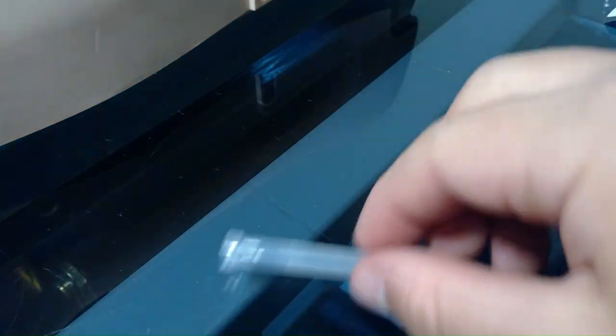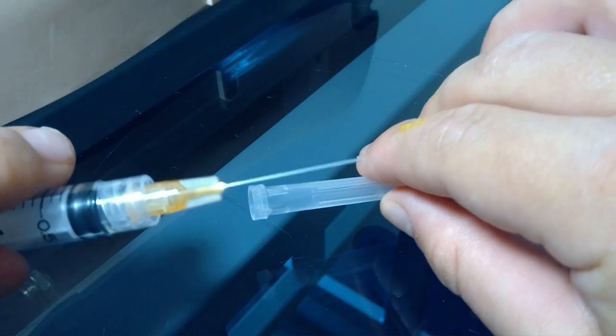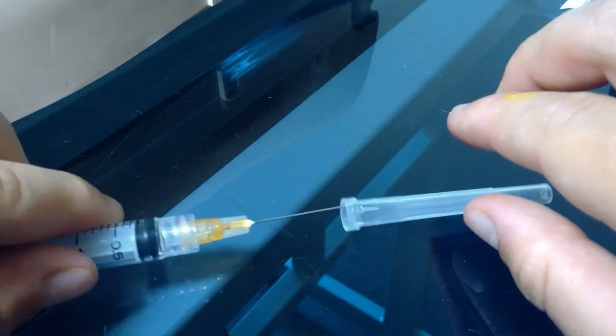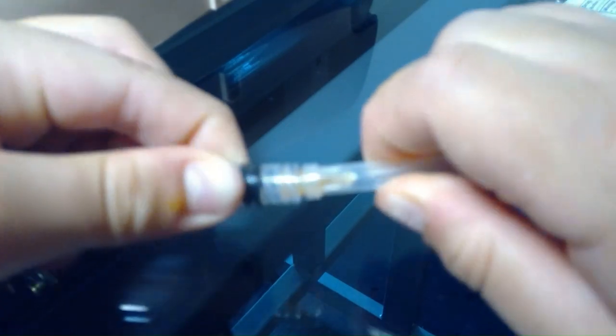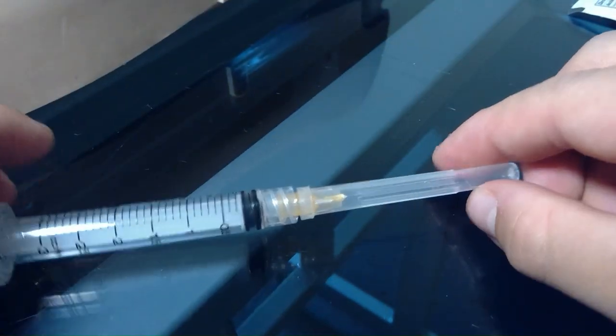There's a method I like to use for recapping. We're gonna set down the cap and instead of just putting the cap on top — which is very unsafe because you could stick yourself — you're gonna take the needle, scoop the cap up with it, and then push the cap on top. Make sure the needle's in the right spot.